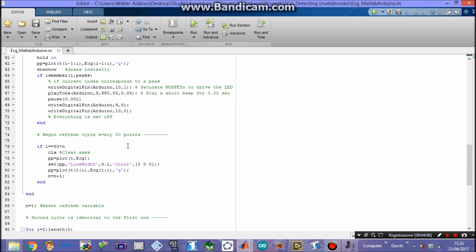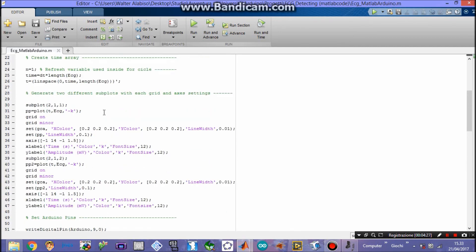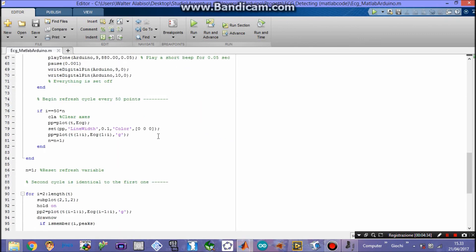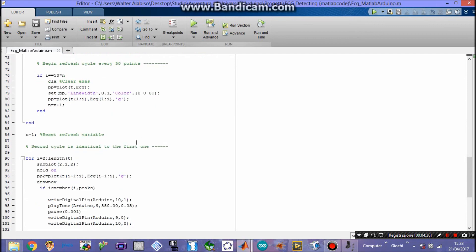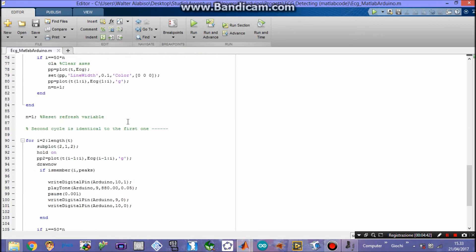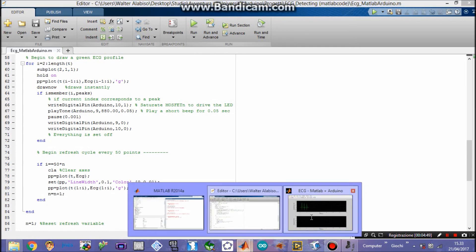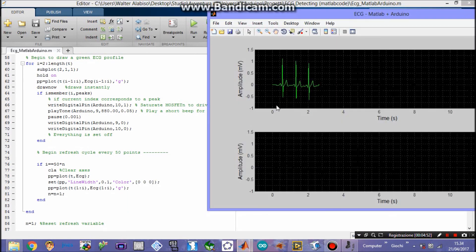Then we need a refresh cycle which will occur every 50 points, thanks to the index we created before, which will increment at the end of every refresh cycle. This will allow the graphics to plot faster, although it can reach a certain velocity limit. This code is pretty expensive for my computer, so the ECG is limited in terms of velocity. The second cycle is identical to the first one — the first cycle is for subplot 2.1.1, the upper one, while the second cycle does the same exact thing for the bottom graphic.